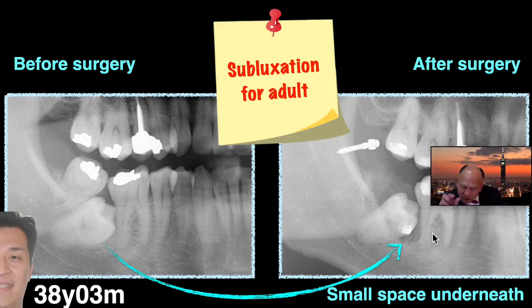Those are very small details. When you listen to a lecture, I hope you pay 100% attention to that. Not every speaker will tell you those detailed procedures, but when I have a chance to give a lecture, I hope I can show you every single detail. For this case, subluxation for an adult patient is a must. You have to do that to protect yourself, and to speed up the treatment.